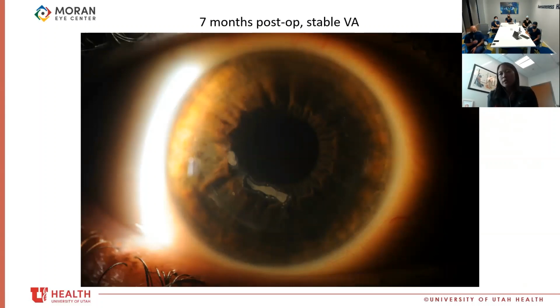Yeah, so this is the only patient that I've tried the YAG on. And again, I'm very hesitant to try new things. In this case, it kind of made me not want to try the YAG again. So I don't know in what cases it is more successful. Is it more successful when they're milder and progressive versus stable? I'm not sure. It just didn't really work in this situation.